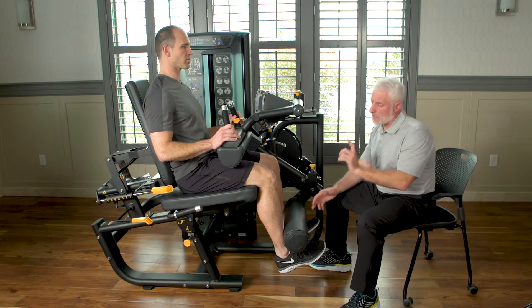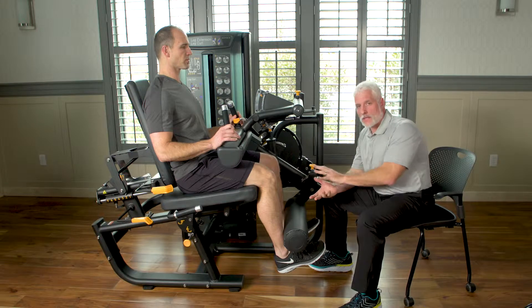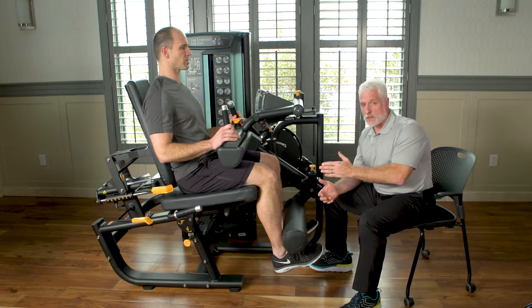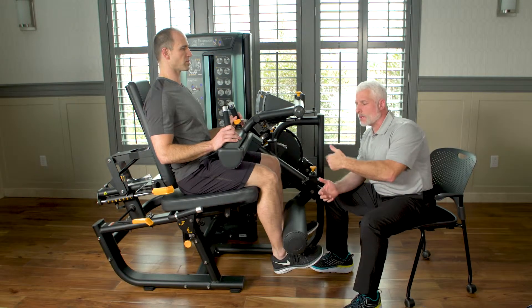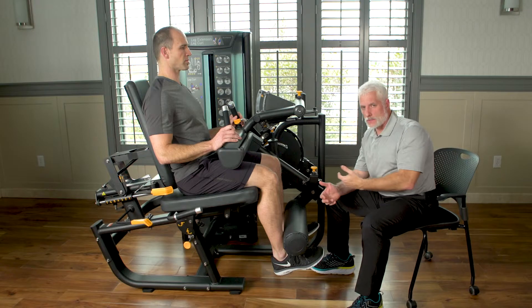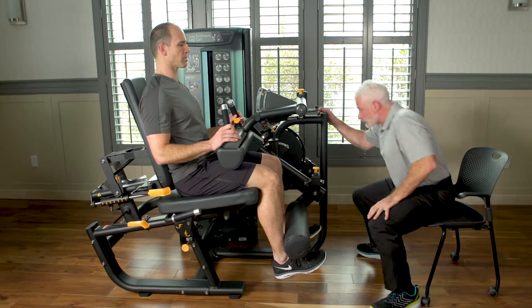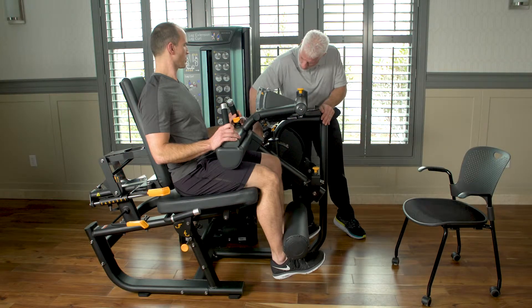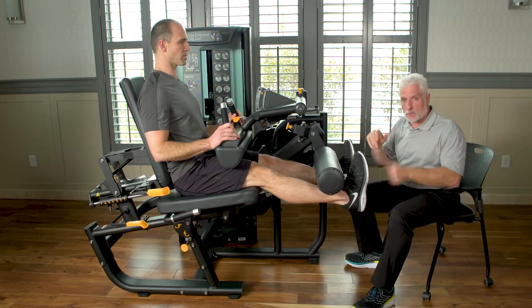If he had a meniscus surgery, patellar femoral surgery, or ACL, this is the range you want to work in the initial phases of rehabilitation. As he moves along into 8 to 12, to 16 weeks out of surgery, we can load that joint even more and open this up. It's very simple to open it up and then bring it back down slowly.